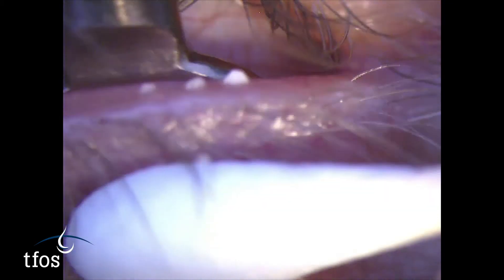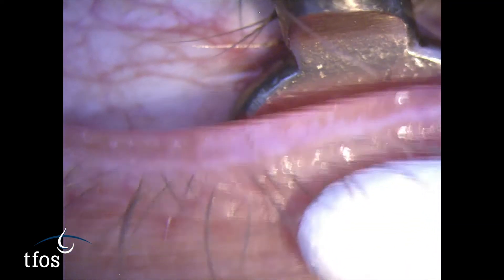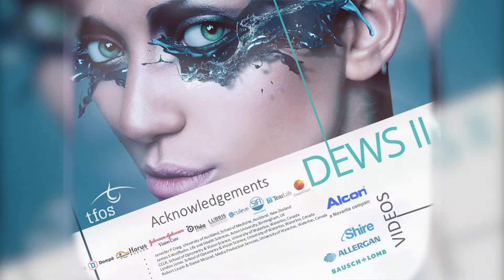Upper lid gland expression is more challenging on account of the rigidity of the tarsal plate, and for the sake of patient comfort, treatment is often restricted to the glands of the lower lid.